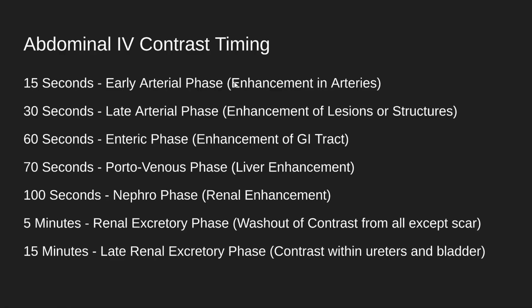We want to visualize blood vessels. We want to visualize lesions. We want to visualize the liver, the kidney. We want to see if there is a washout. Is there contrast in the ureter and the bladder, and so forth. So you can pause the video, but you should know these phases. They will be important to characterize possible lesions or otherwise.